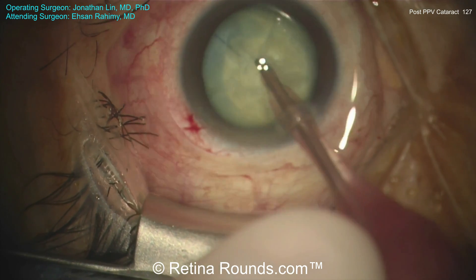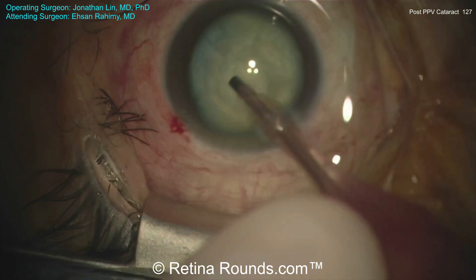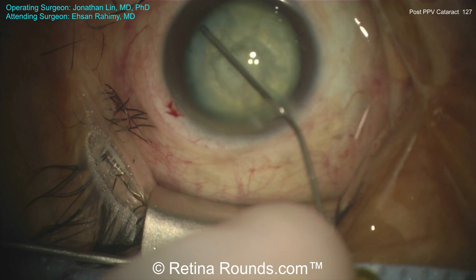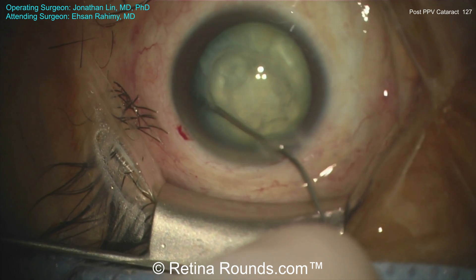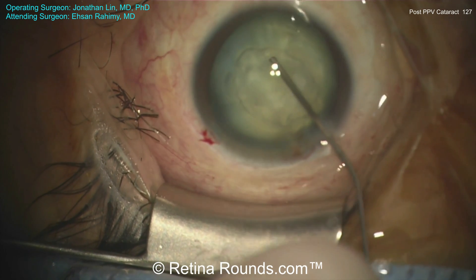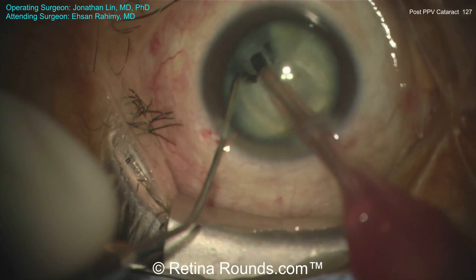Some trypan blue has been used and the capsulorhexis is created. Some hydrodelineation is being performed. Now the phacoemulsification probe is being used to debulk some of this very dense lens material, bowling out the lens to debulk it as much as possible. Dr. Lin has then gone to using a viscoelastic on a cannula to visco-dissect the lens away from the posterior capsule. This is a gentler way of creating space between the lens and the posterior capsule, and also serves as a barrier so that if there is a posterior capsular violation, the viscoelastic will prevent lens material from migrating into the posterior segment.